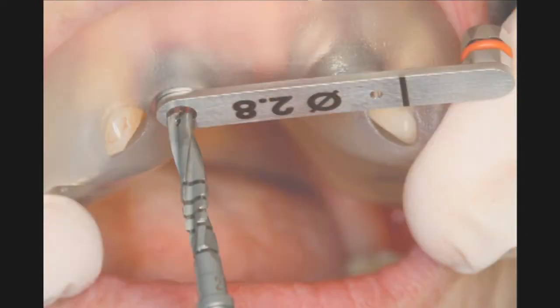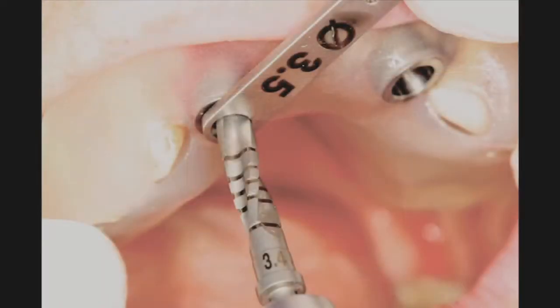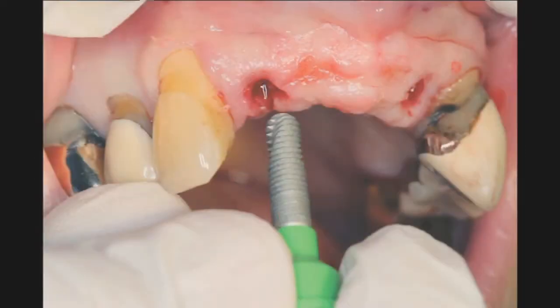Following this, we simply move to the next size key, which here was a 2.8 diameter. This would be the final drill for this relatively soft bone. A 3.4 dense bone drill was used to create the final width of the osteotomy to accept our 3.7 millimeter diameter dental implant.